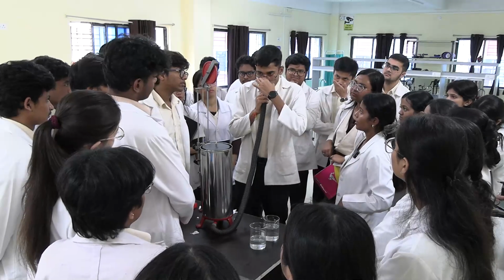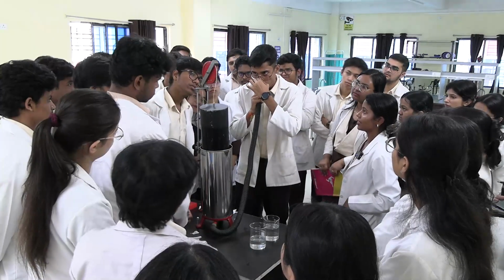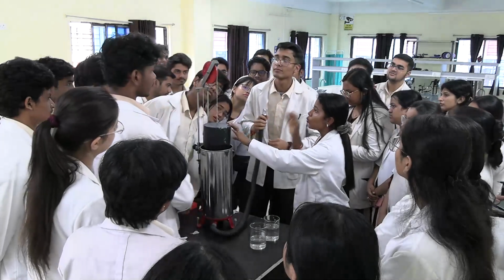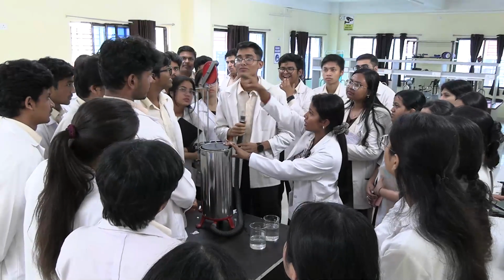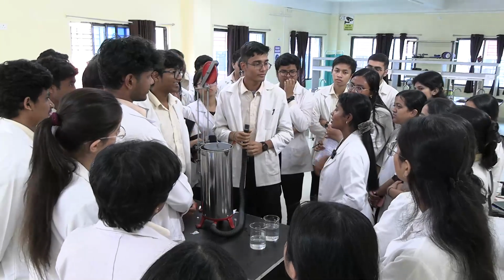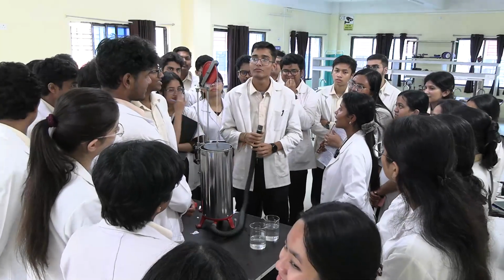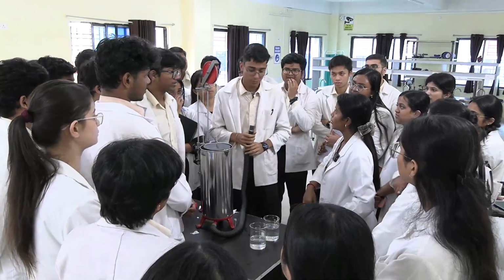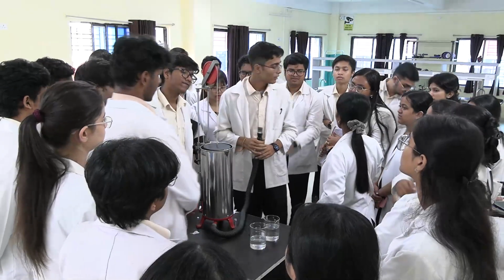Breathe out. How much is it? Okay, one more thing I forgot to tell you. While you are performing, you should not see the dial. Why? Because you will try to manipulate it. You will be knowing it. So while performing, either you see the other side or look down, then perform. So these are the precautions.